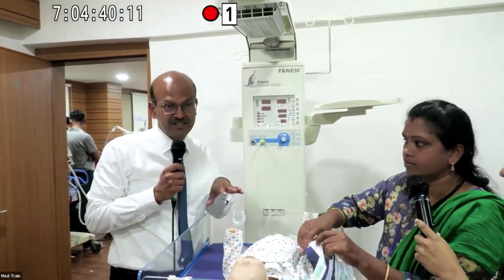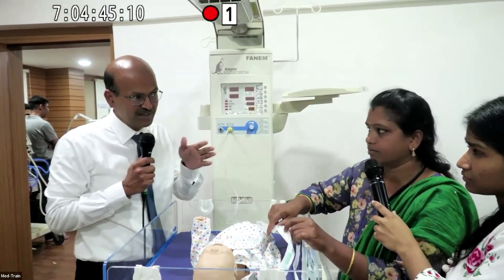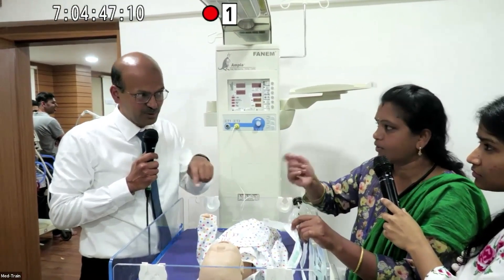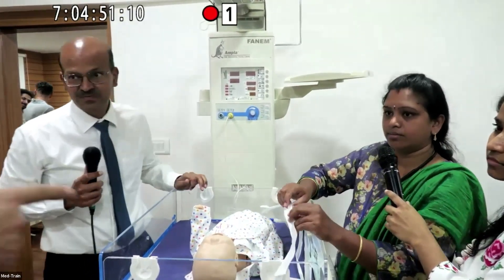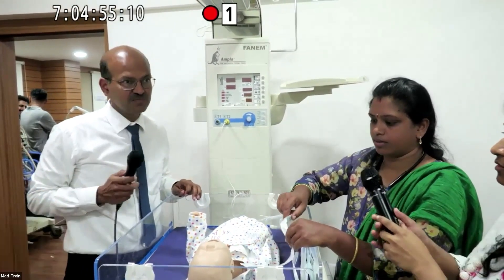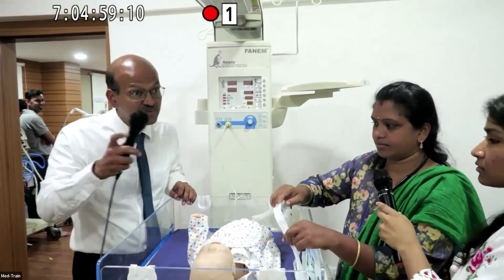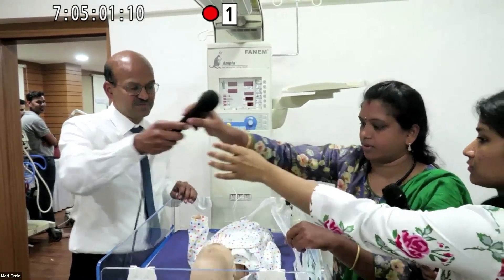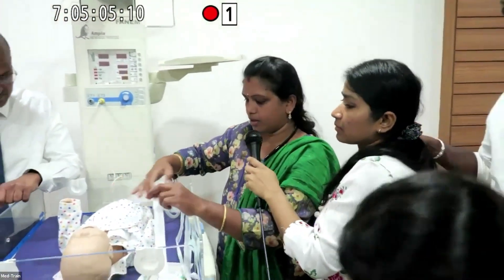In the NACU, you would not do the mouth first because the mouth is more colonized. You should not use the same catheter for oral and nasal suctioning — different catheters should be used for each.